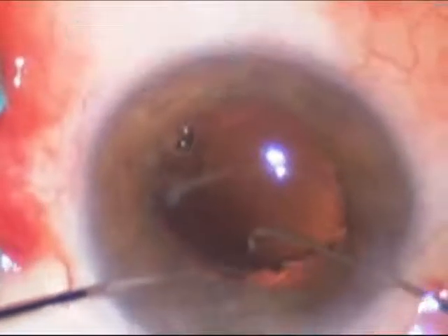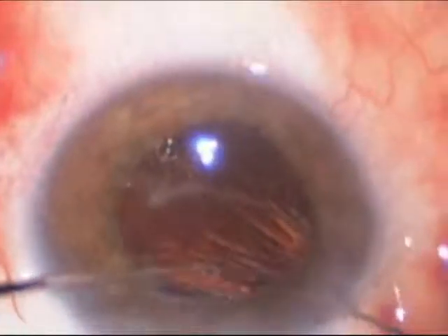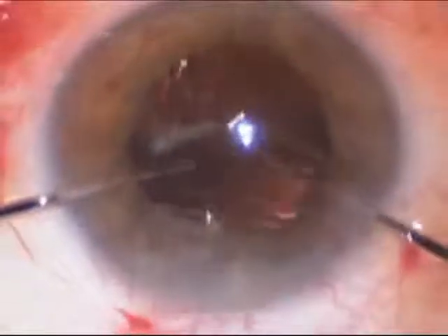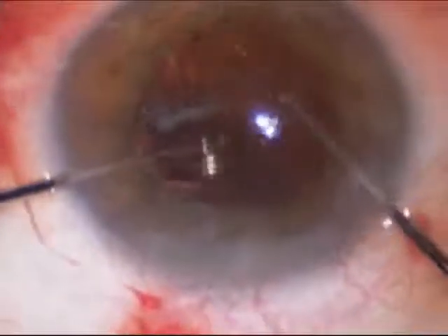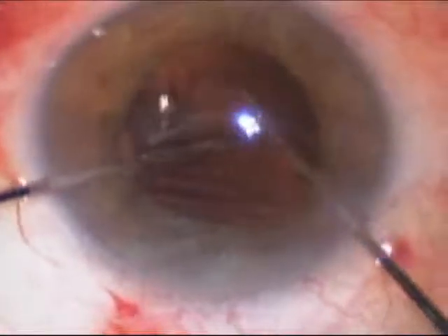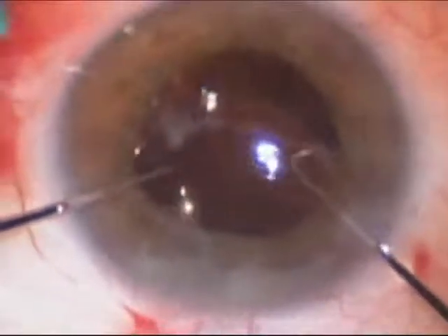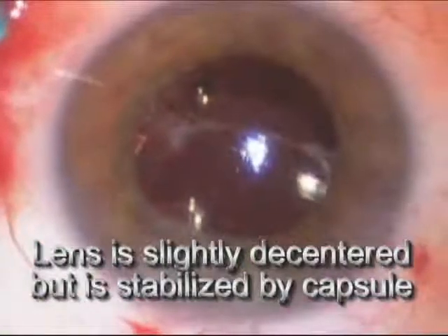You see the top part of the optic being put inside the capsule, and then the bottom part of the optic follows. Things are upside down because we're looking at the patient from the top of his head. The view is a little bit hazy because the eye has been softened to allow the lens to properly position. There you see the other part of the optic being tucked behind the capsule. What keeps the lens from falling into the posterior chamber are the two haptics, which are the spring-like pieces coming off of the edge of the lens.